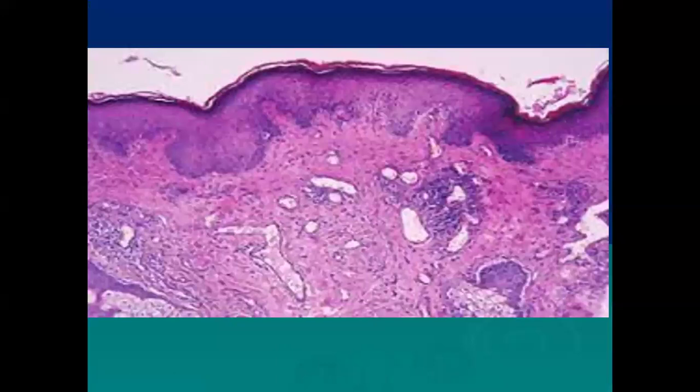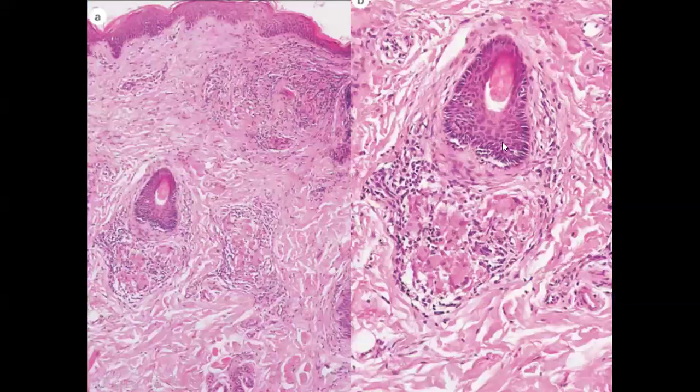So a normal rosacea would give this appearance, that is dilated blood vessels, which are the hallmark of telangiectasias, and surrounding lymphohistiocytic infiltrate. But if we reach the nodular or granulomatous stage, you would see small granulomas surrounding the hair follicles. So granulomatous rosacea is one of the histopathological differential diagnoses of perifollicular granuloma.